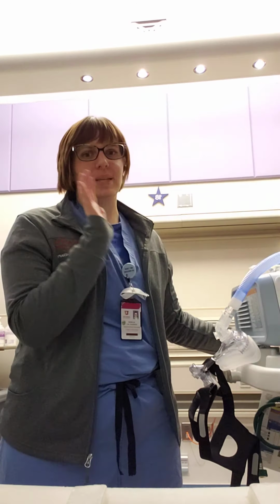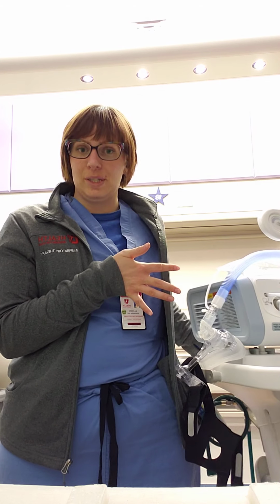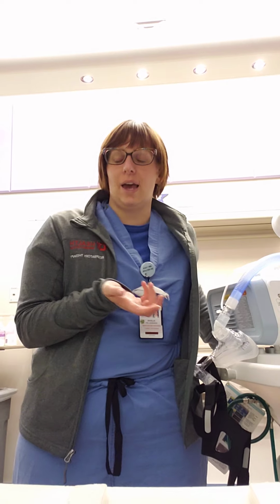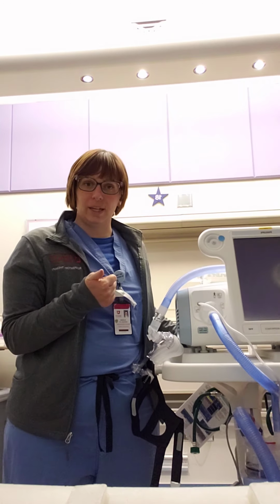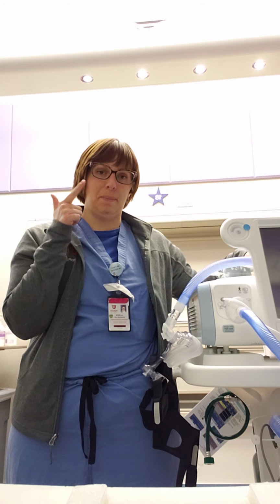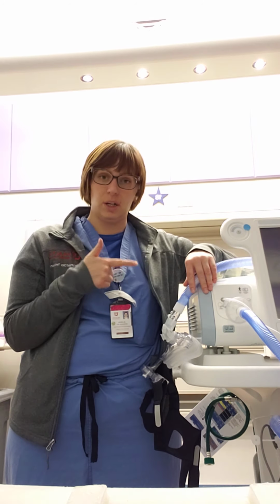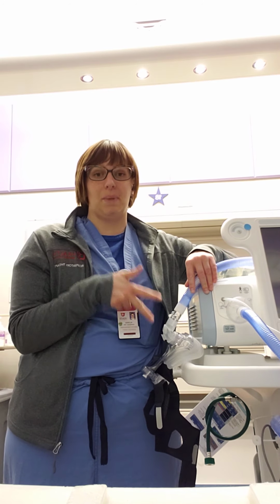We're going to start by saying you are called to a room to set up a Bipap for a patient that is having respiratory distress. I come in, I grab all the supplies I need, which includes my sterile water for inhalation, my Bipap, make sure I have a clean circuit that's ready to go and is set up properly, and then an appropriate sized mask for the patient.